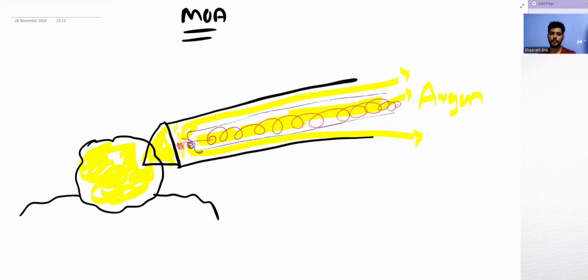When it expands, because of its nature, as I told earlier, it heats the probe. The probe is heated now, and the tissue that was frozen is thawed. Okay? Thawing happens, and then it escapes. Then again we send argon gas, and then again we send helium, and this process is repeated. That's how it happens. Now, what actually happens when you freeze the tissue?